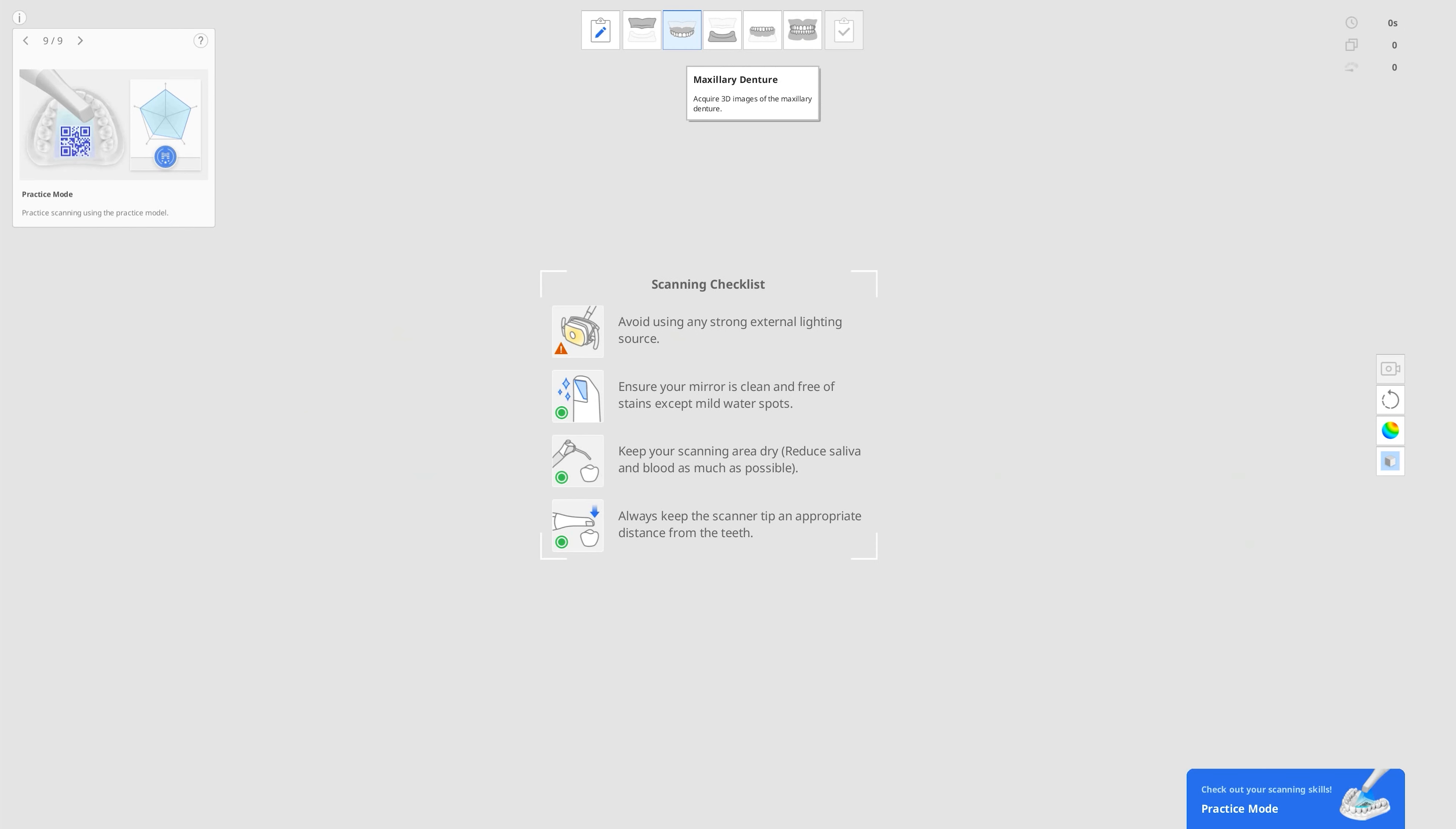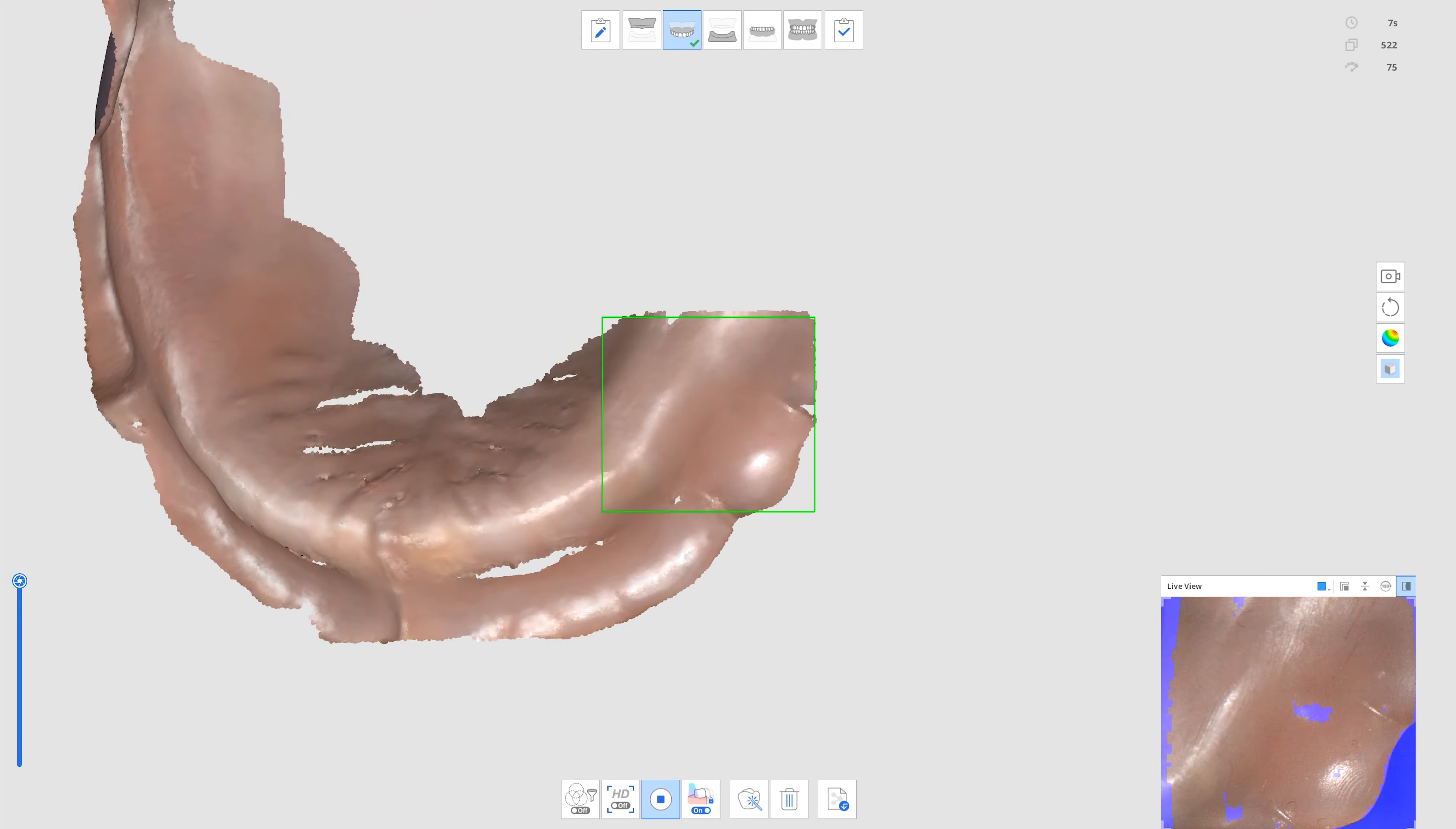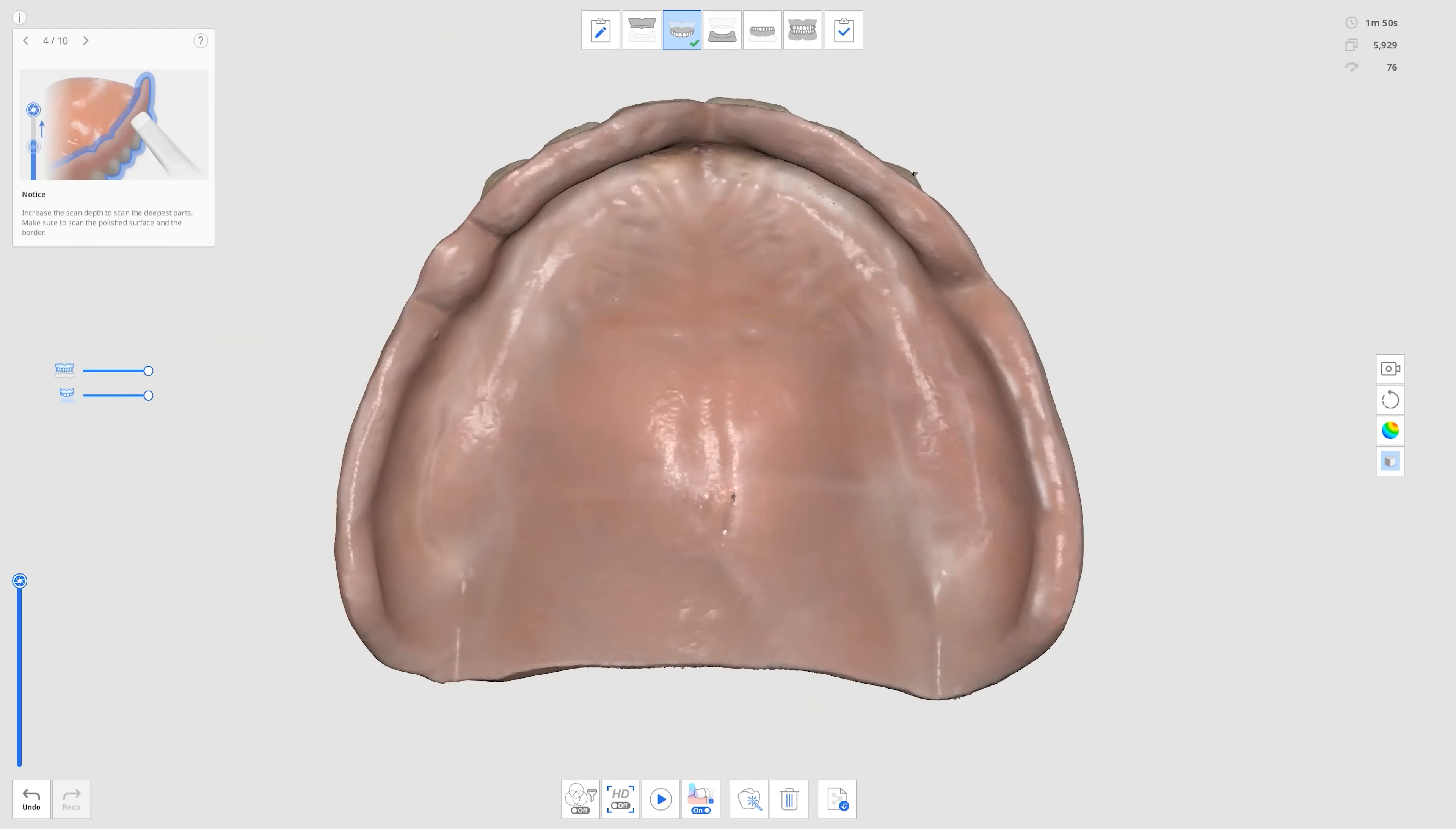With the Denture first scan process, you can now scan data in the Denture stage first, regardless of whether you've acquired data in the Edentulous stage. This can be utilized for over-denture creation.